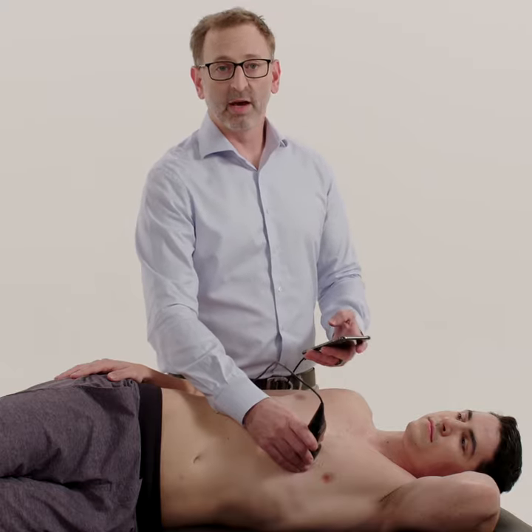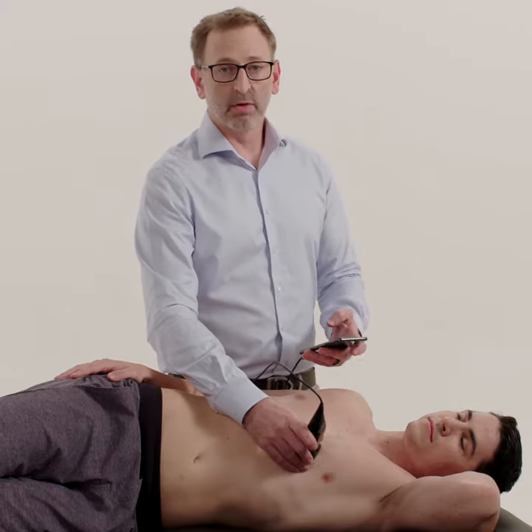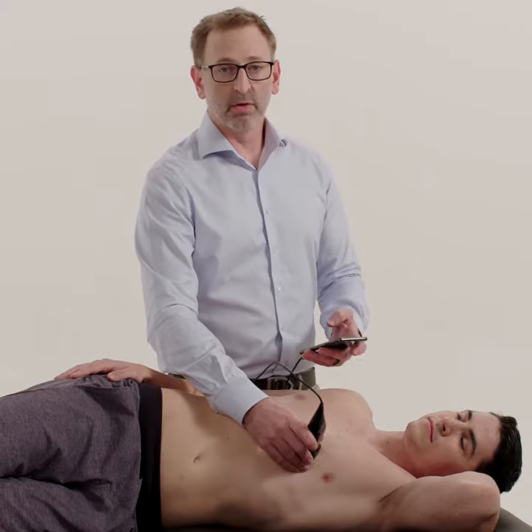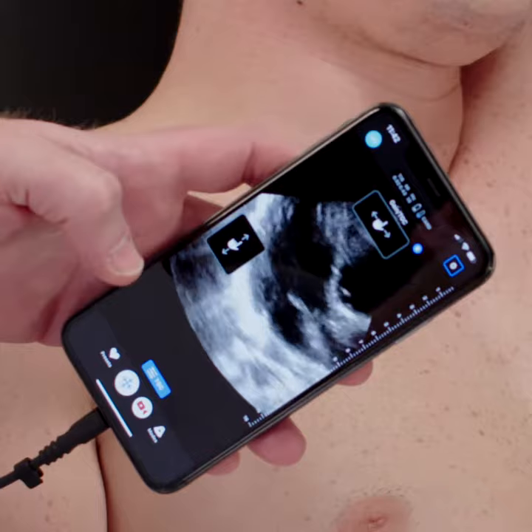To optimize your cardiac exam, make sure you choose a cardiac preset. This preset has a high contrast and frame rate optimized for cardiac imaging.